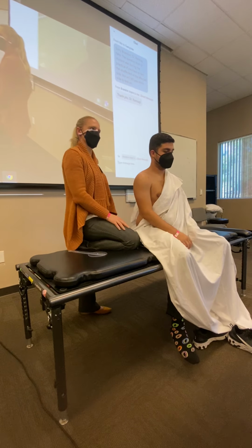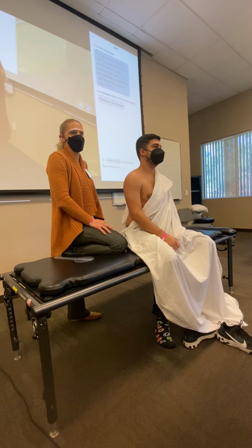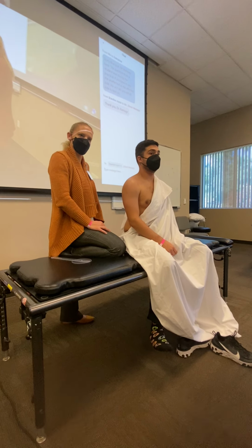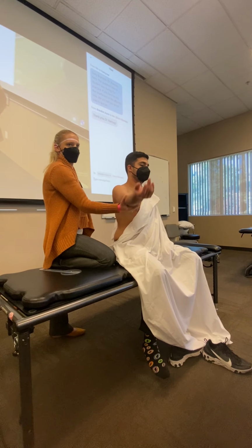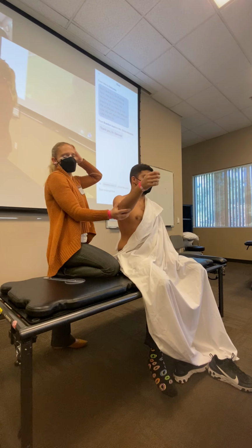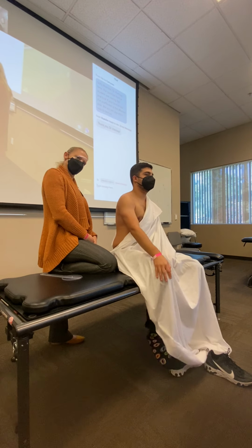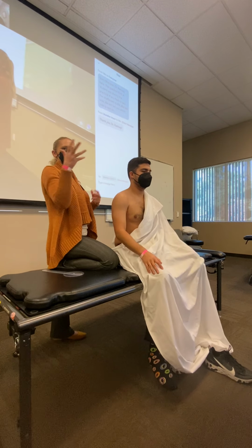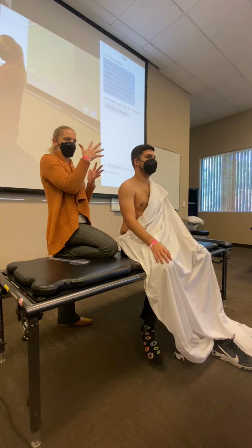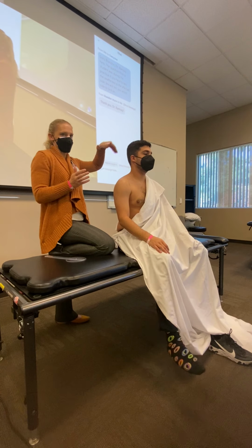Just relax. Is there a lower range for that compared to the other side? Oh, that's right, question on those two. So you said supinate the arm and then externally rotate the shoulder, same as before. Yep. Flex, and then max flex, or not maximum, but where you feel that muscle resistance. And when you flex the shoulder, are you taking that to end range? End range. So with all MLTs, you want to go to the end range of the other muscle actions to put that part on the maximum stretch, and then you're measuring the last thing you're moving.